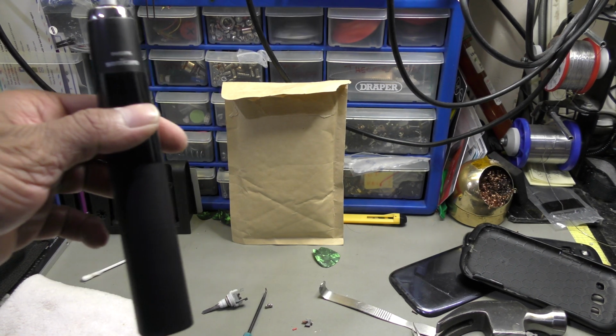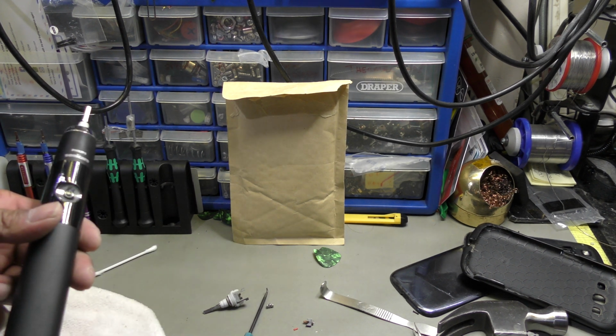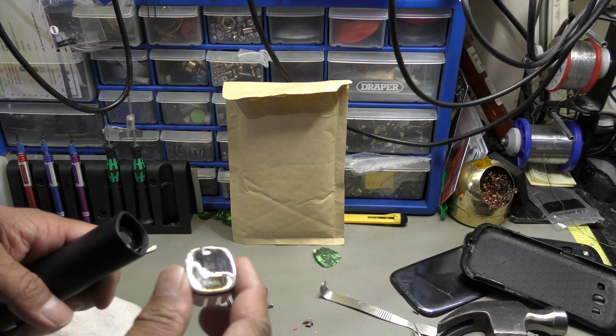This unit was about £230 when I bought it brand new, so I'm not going and buying another one basically. The other thing is that Philips Sonicare don't do this series anymore. As always, they've discontinued that. The one other thing that I didn't discuss is how to take this cap off.